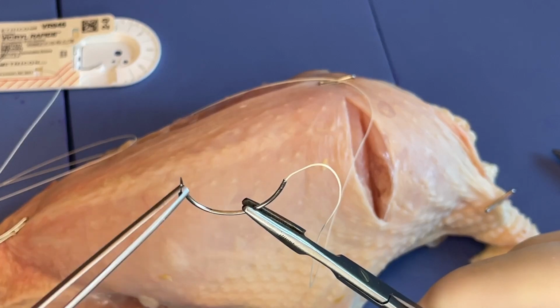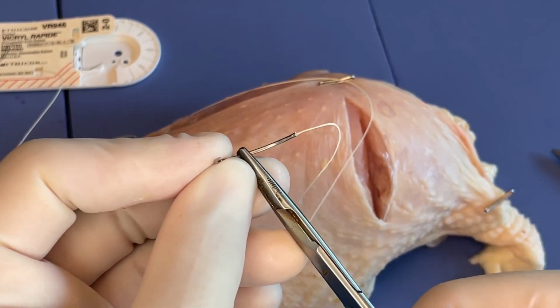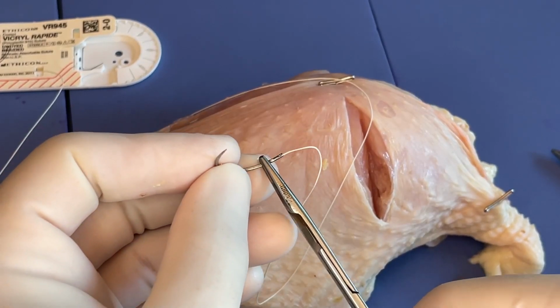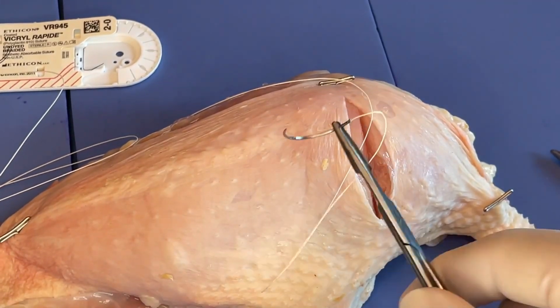We've got here the full curve of the needle, and what we typically do is grasp anywhere from about halfway back to a little bit closer to the swedged end, depending on how much needle length we need to drive through the tissue.